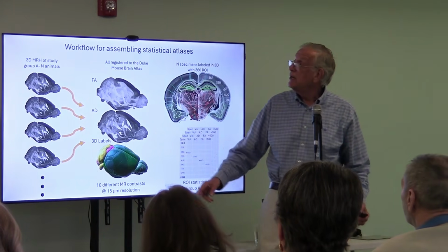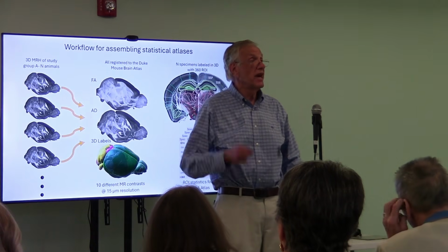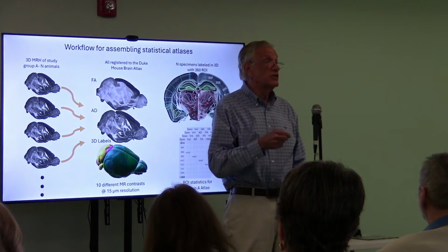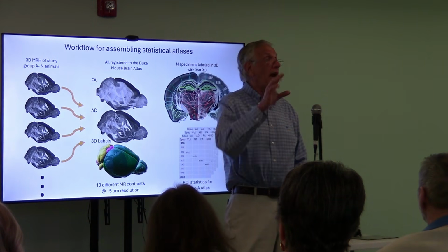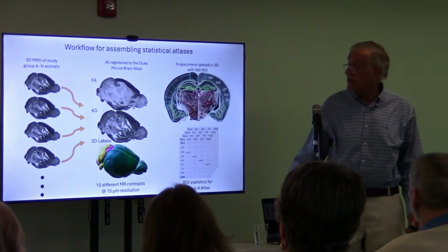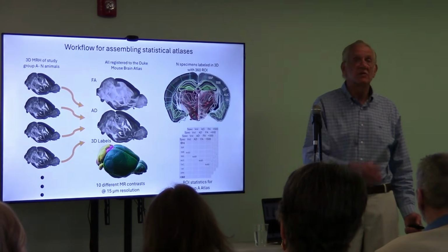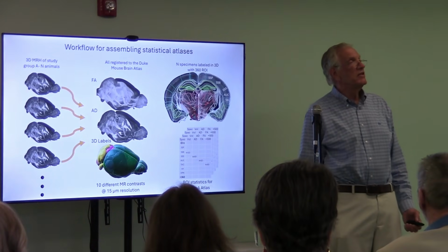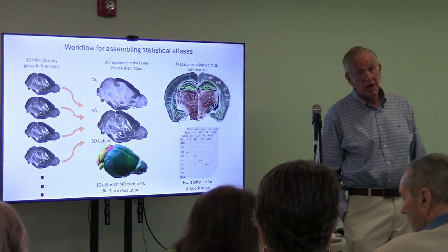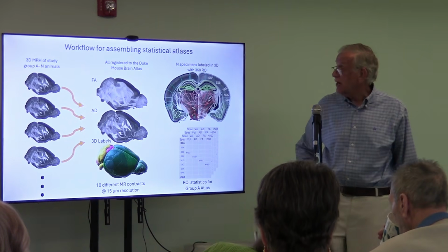We then take a group of animals, let's say 12 BXD29s at 6 months, 12 BXD29s at 6 months, with a transgene that causes Alzheimer's. And now I can start pushing those through and create a population atlas, which spits out a whole bunch of spreadsheets. I was talking to Chris about the amount of data that Glaxo might undertake for a clinical study. And they're talking about something on the order of megabytes. We're talking about petabytes.